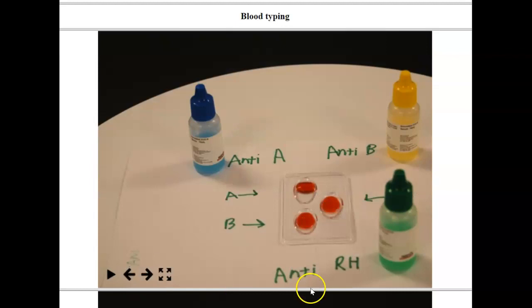Okay, there it goes. So, this did not agglutinate, this agglutinated, this agglutinated. So it is B positive, my favorite one. And our suspect, if we read it, was not B positive. The killer was B negative. So even though Ernie is our prime suspect, looks like he didn't do it.